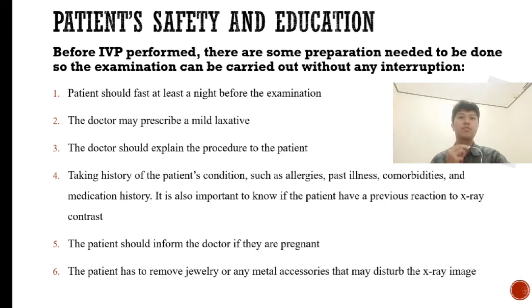The next is patient safety and education. Before IVP is performed, there is some preparation needed so the examination can be carried out without any interruption. The first is patient fasting at least a night before the examination. The second, the doctor may prescribe a mild laxative to empty the digestive tract. The third is the doctor should explain the procedure to the patient. The fourth, the doctor may take the history of the patient's condition such as allergies, past illness, comorbidities, and medication history.